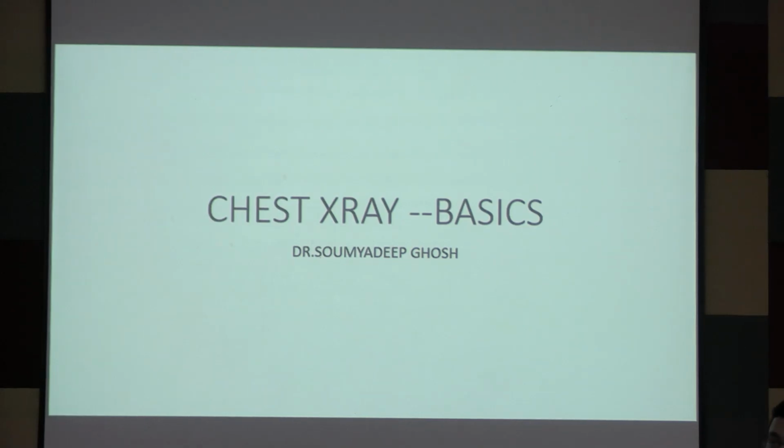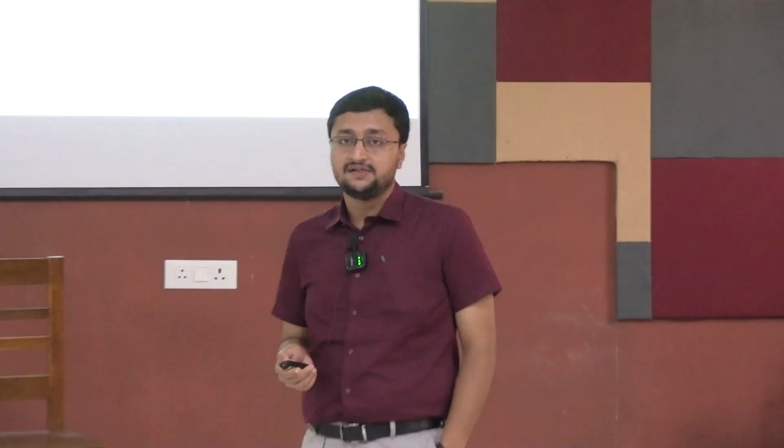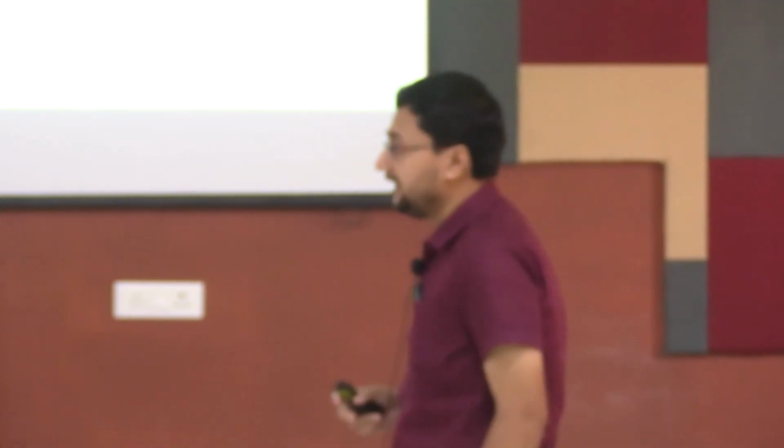What are the views of chest X-ray? How is the chest X-ray taken? Is it in correct posture, or is it rotated, and many other things.